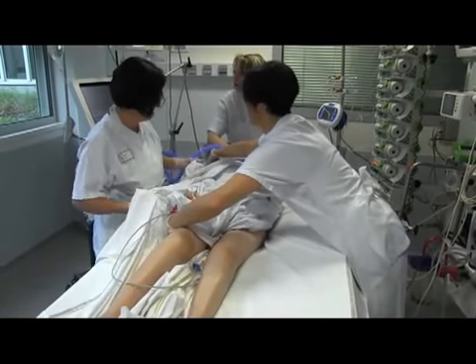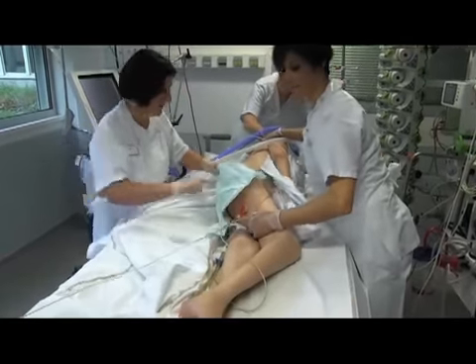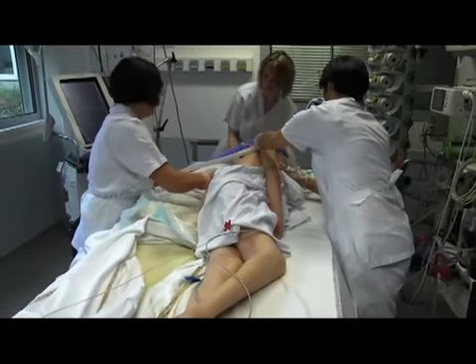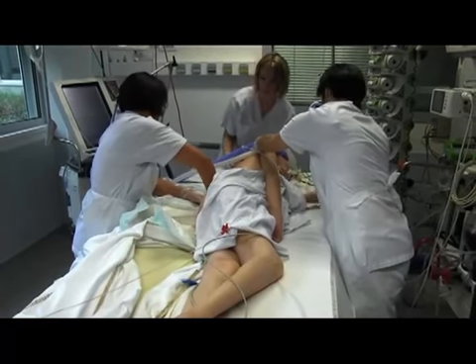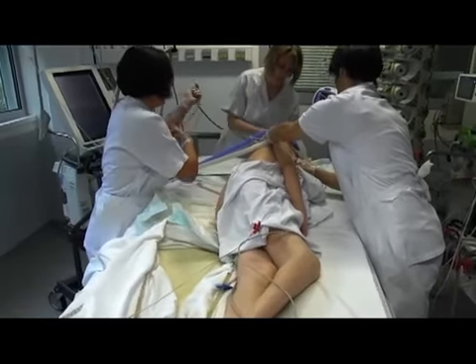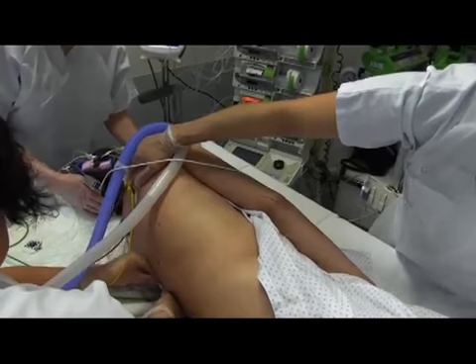The third step is a side-lie. The patient is rotated laterally into a full side-lying position. The patient is maintained in this position for a short time while one person removes the electrodes from the anterior thorax and another person attaches the new electrodes to the back.